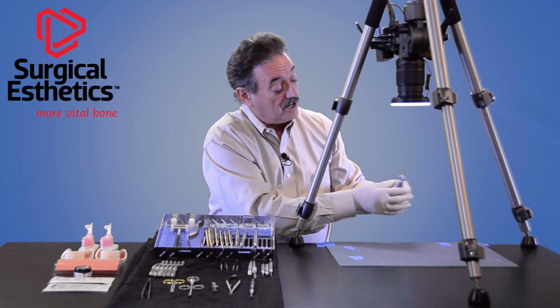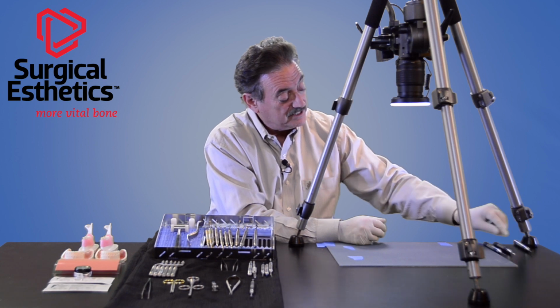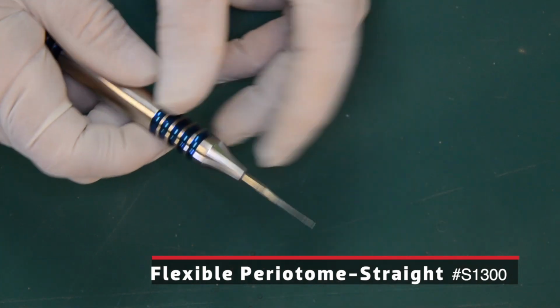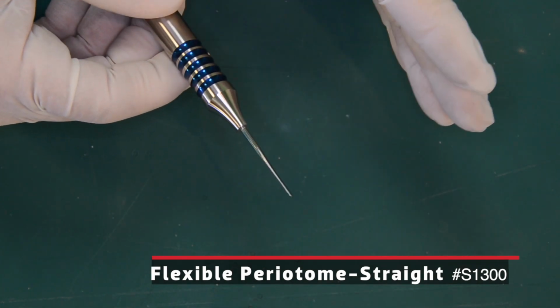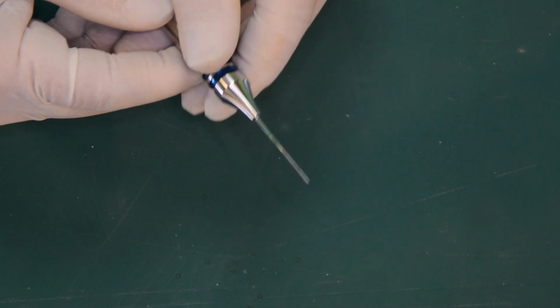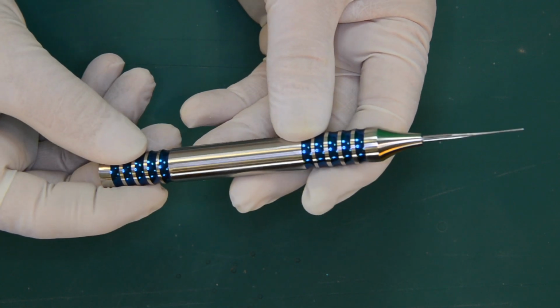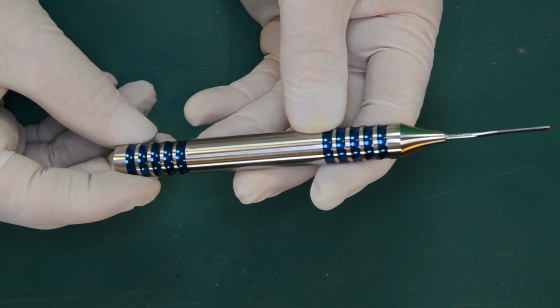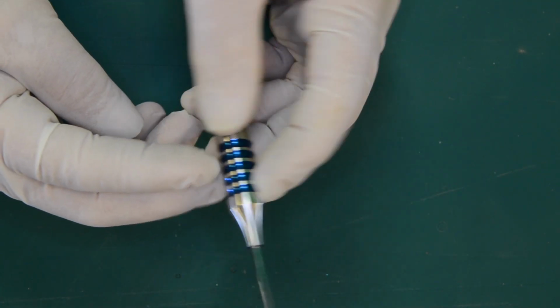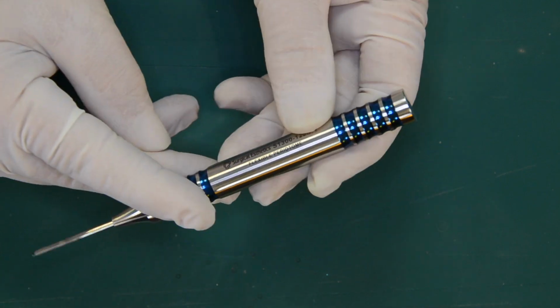The next group of instruments are our Periotomes, which are instruments that I really love. Our particular Periotomes have very flexible ends so that the instrument can move down the periodontal ligament space between the bone and the tooth, severing that ligament and thereby loosening the root. Again, you can see this instrument is single-sided. Periotomes that are double-sided mean you have to use muscular force to push the instrument up the PDL, and I find that almost impossible. So the single-sided instruments are designed to be used with a mallet.